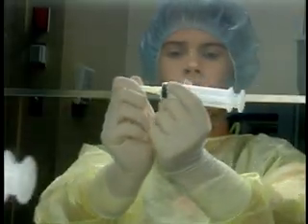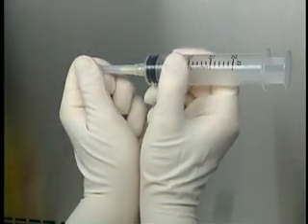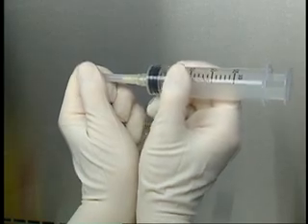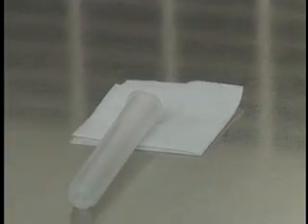Holding the barrel of the syringe from underneath, grasp the extremity of the needle guard between your thumb and index finger. With your wrists pressed together, pull on the needle guard, moving your hands away from one another. Place the needle guard on the alcohol swab, the opening towards the back of the hood.